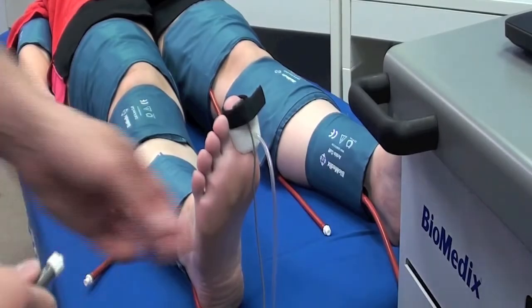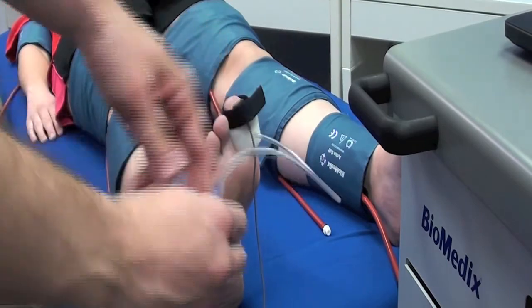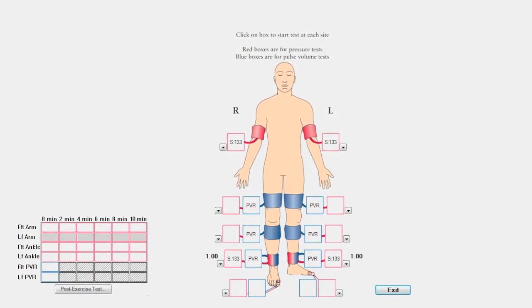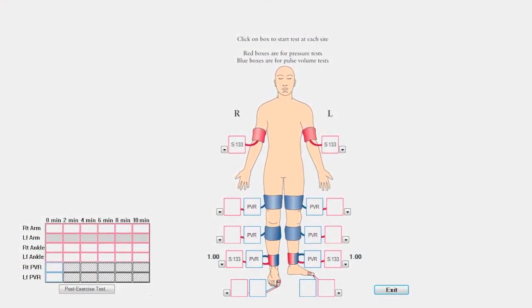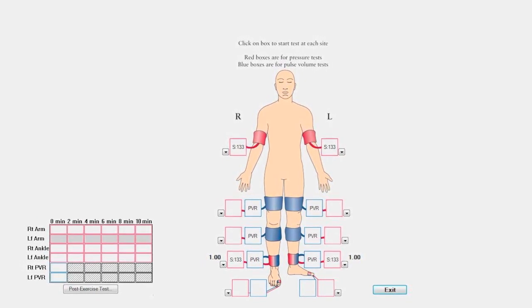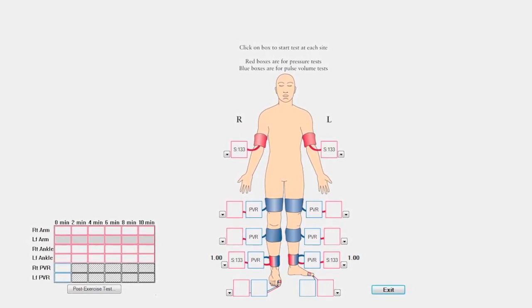The toe measurements, while clinically valuable, are not necessary to perform the highest level study. Should you skip the toes, arterial testing is complete. If the patient has non-compressible vessels at the ankle level, you may wish to also complete all toe pressures and PVRs, starting at the right toe using all the same pressure taking and PVR procedures you use for the ankles. Repeat the process at the left toe.